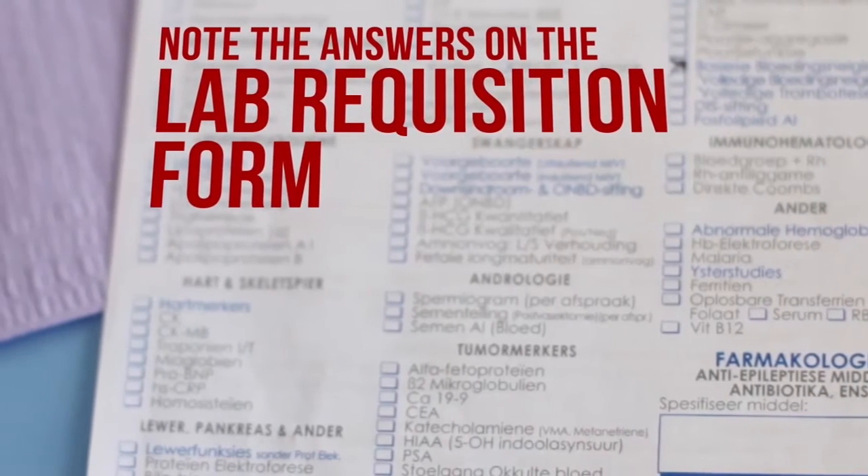Third, verify relevant information like fasting, dietary restrictions, and medication, and note the answers on the lab requisition form.